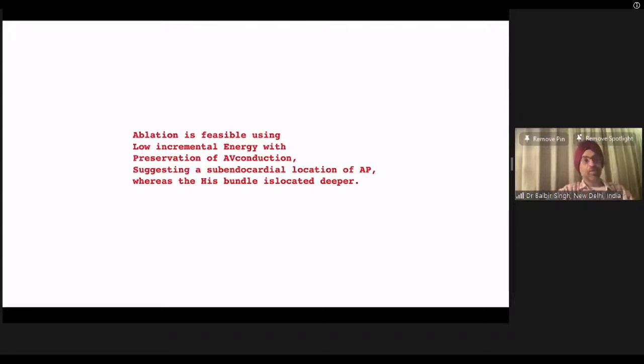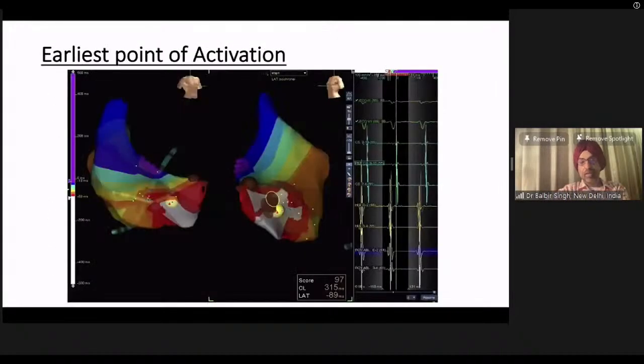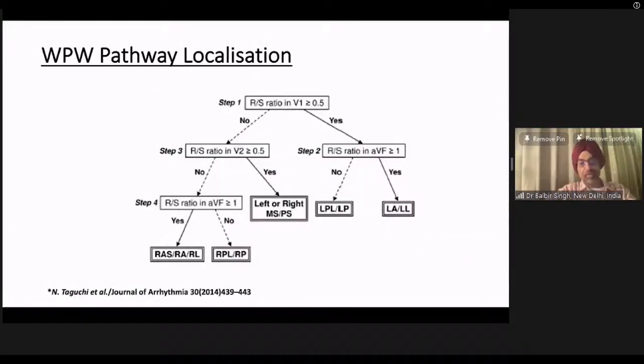You have to be very careful while doing it. You have to ablate during SVT. Start with low voltages. Make sure your catheter doesn't move. So as in this patient, we were on 3D. So even the fine movements would have been picked up in this patient. So this is about an anteroseptal pathway and its ablation. So I guess right bundle branch block on the long term will not have any major consequences in this patient who is highly symptomatic. Narasimhan, over to you now for this case.